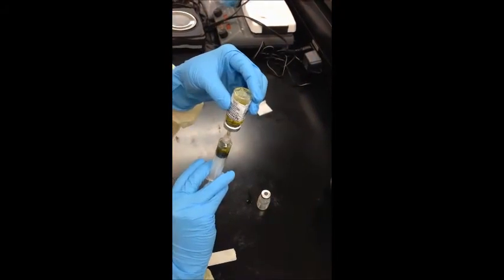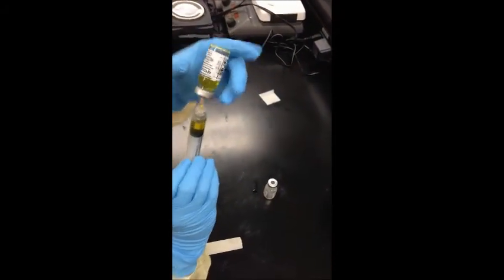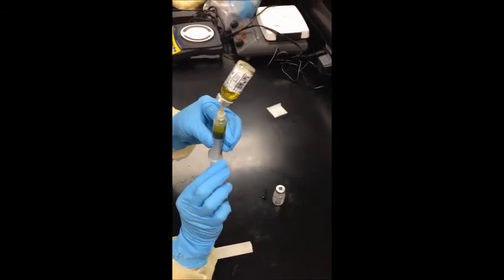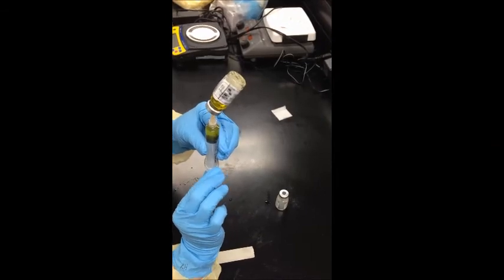Lift the vial up with the needle still in the vial and draw desired amount into the syringe. Make sure to tap the barrel of the syringe to get any air bubbles out. Again, make sure that critical sites are not touched and are facing first air at all times.